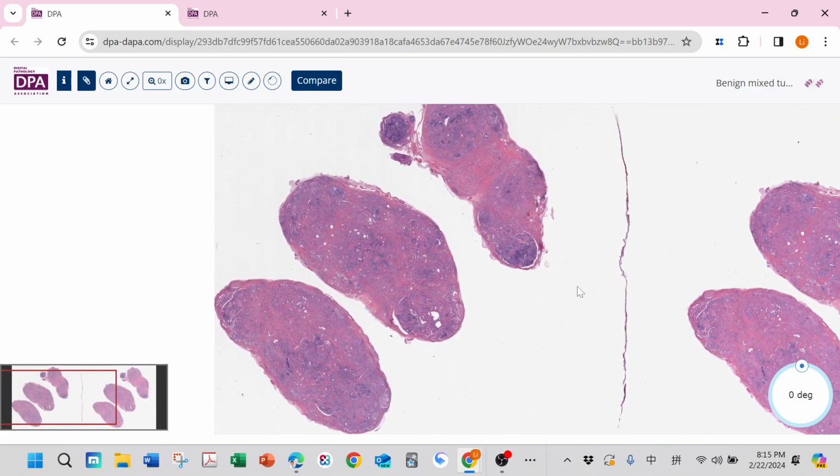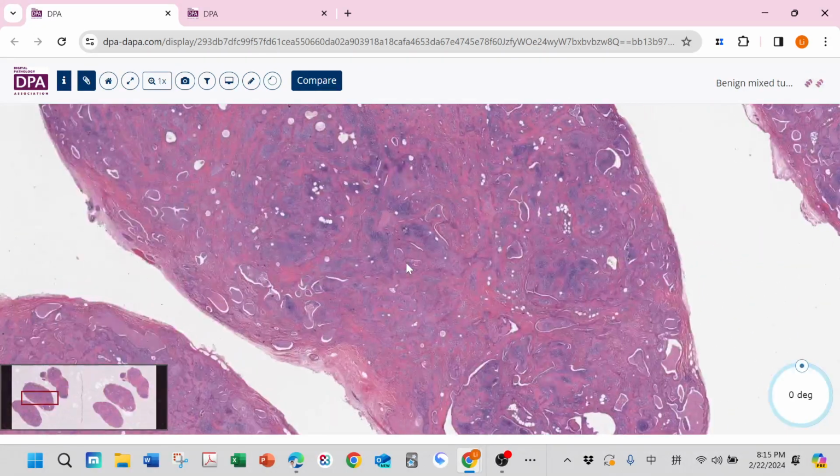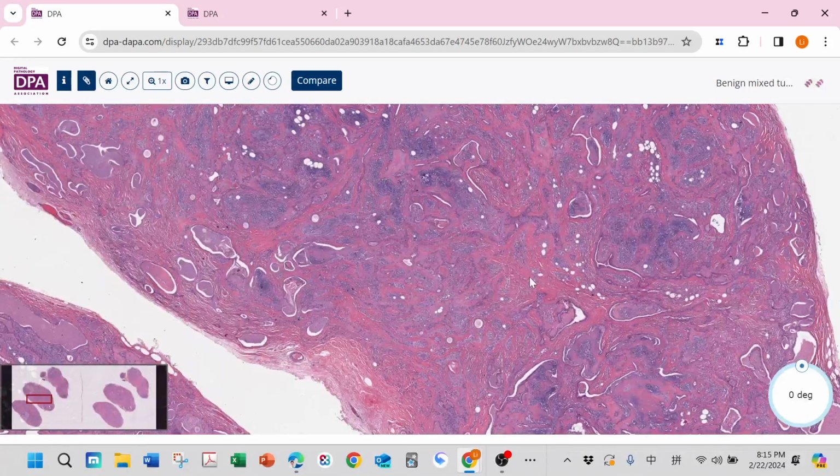This one we do not have the epidermis, just like an enucleation. When the clinician tries to scoop this lesion, the whole thing just pops out. Then this one, we still focus on several components.